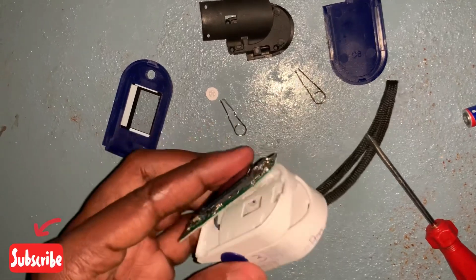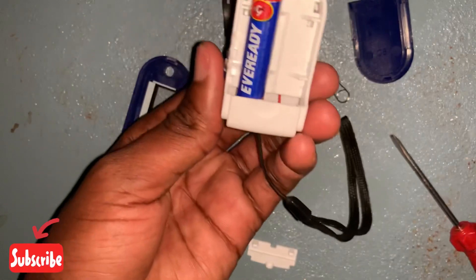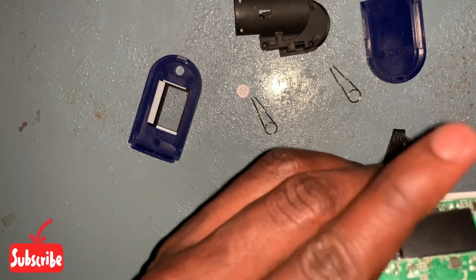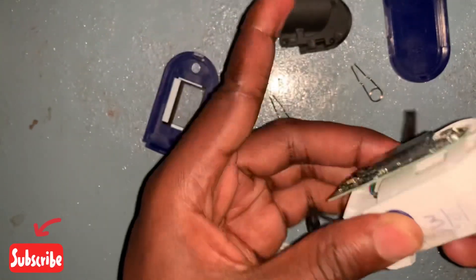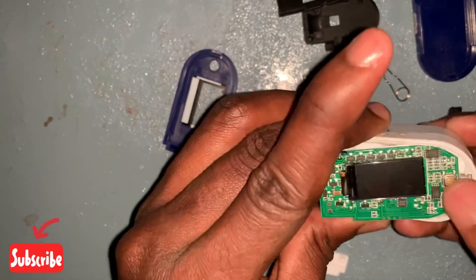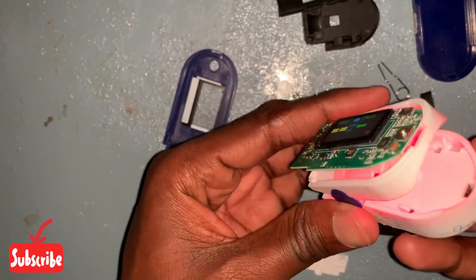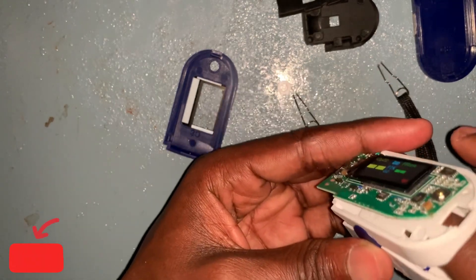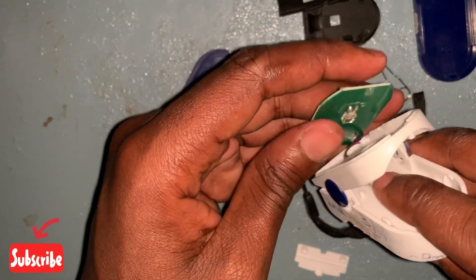Let us try putting on the battery as it is and see if maybe it works. The battery is not put in the right position so it doesn't work. Now let's put it in the right position — and it works. You can see the LED light down here. This is the sensor that will measure the amount of light absorbed by my finger.